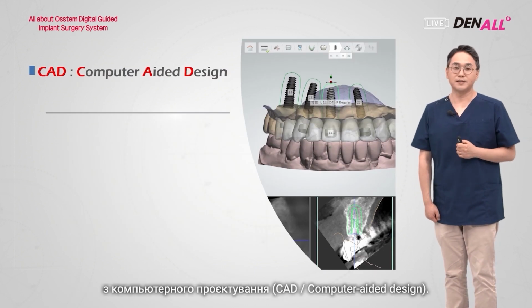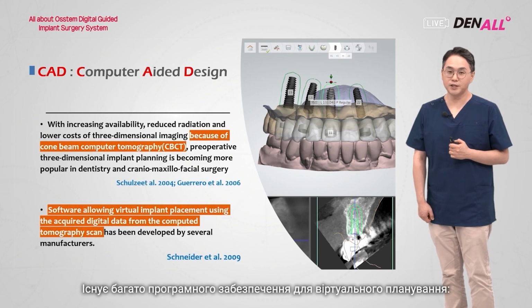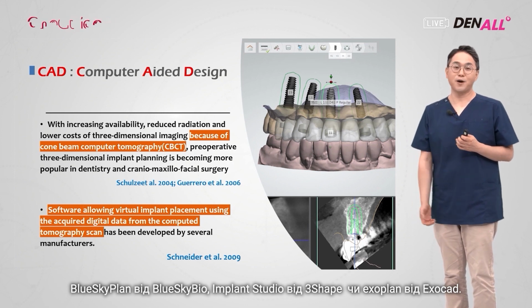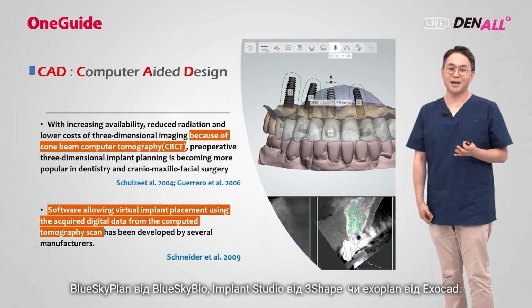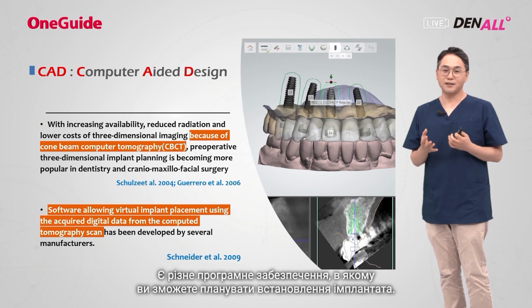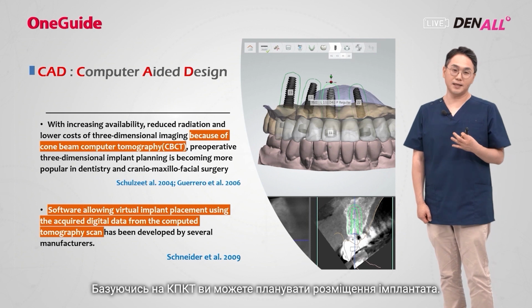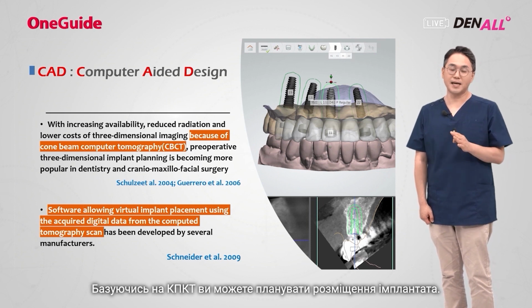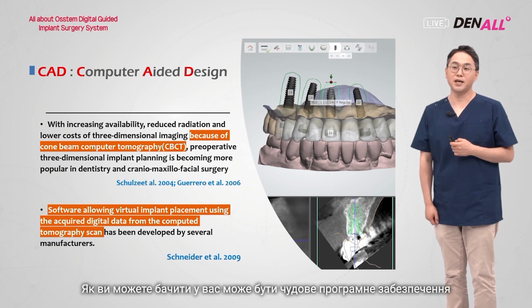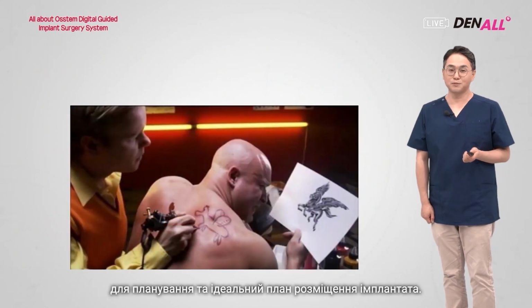Another major contributor is CAD programs. There are a lot of virtual planning software: Blue Sky Plan from Blue Sky Bio, Implant Studio from 3Shape, and ExoCAD's ExoPlan. There are multiple software where you can plan implant placement based on the CT data gathered. That's called a CAD program.